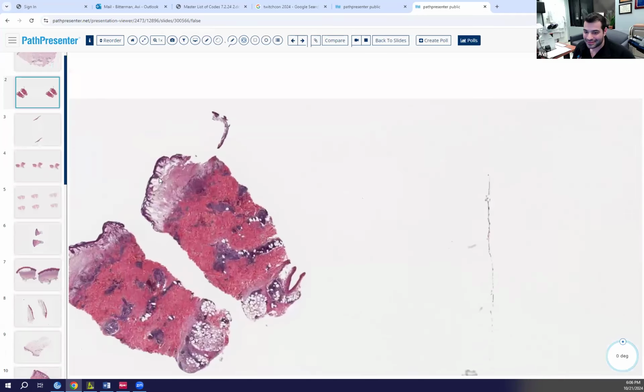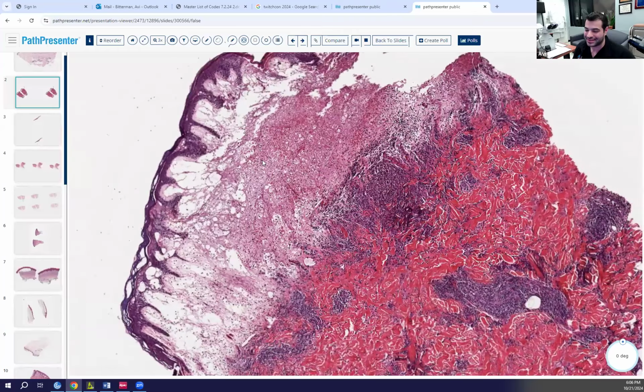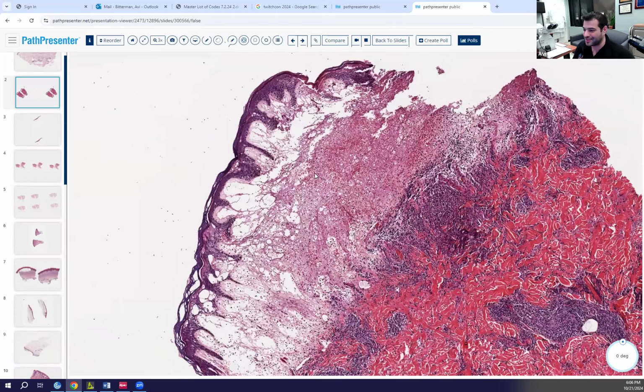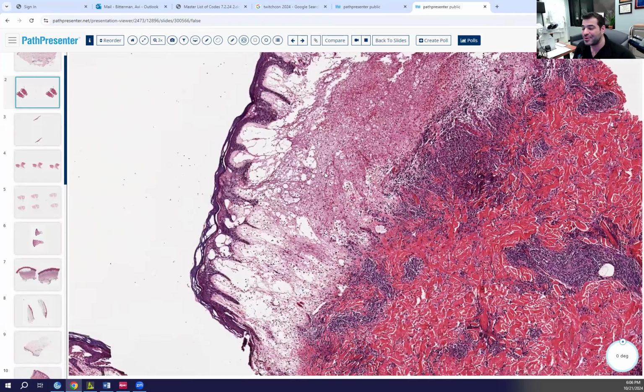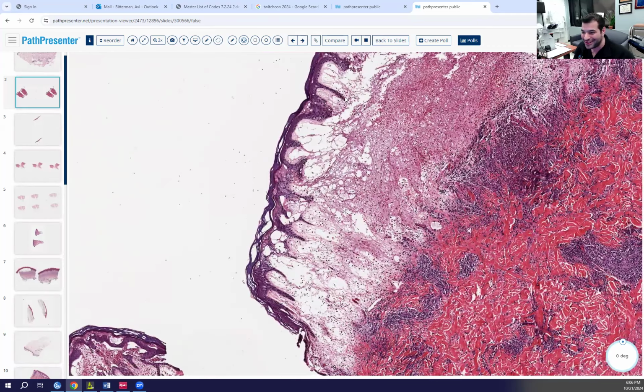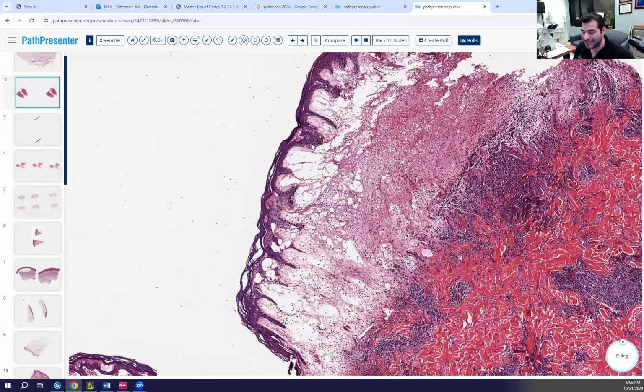Here, this is the opposite of a clean split. This is just ripping it. This is the hydrostatic pressure of the edema saying, no, you've got to go. And you have these gossamer strands that are just hanging on for dear life. Like, no, don't let me go.